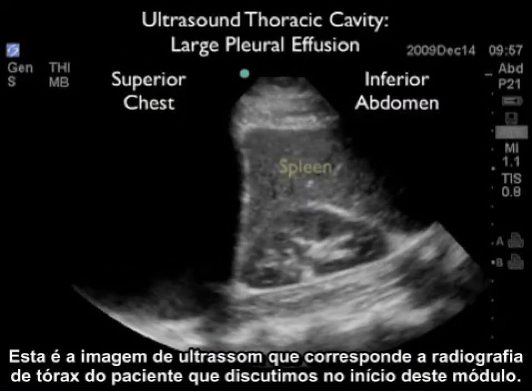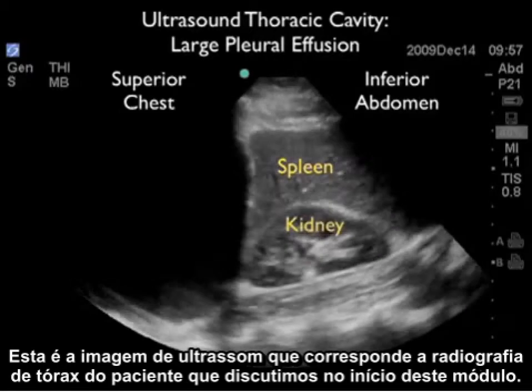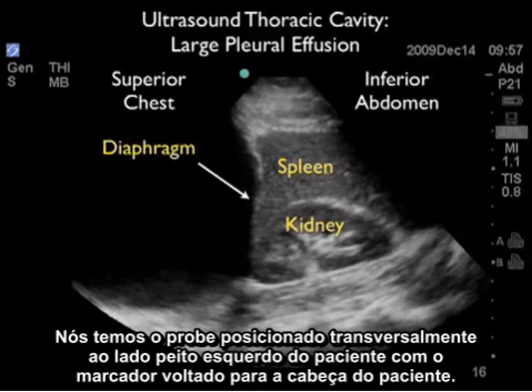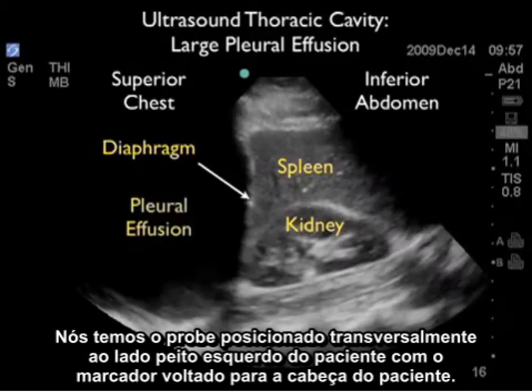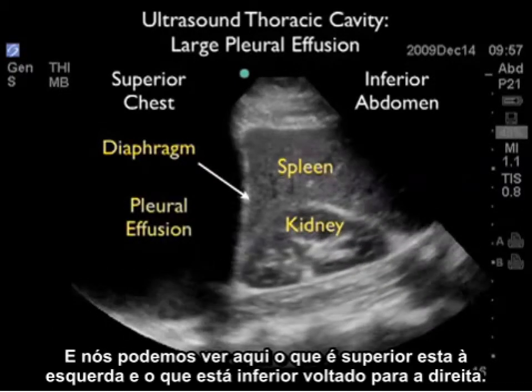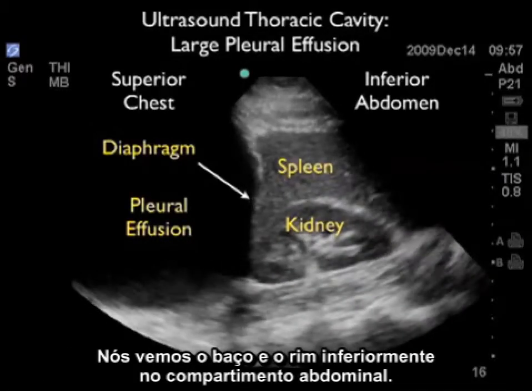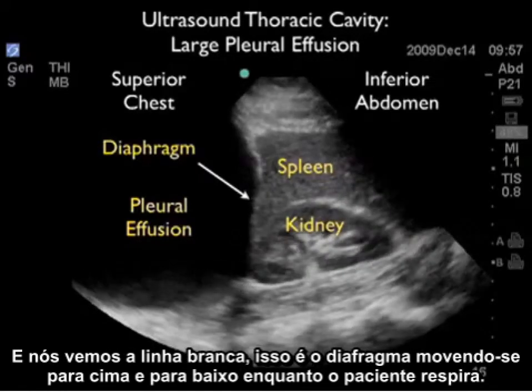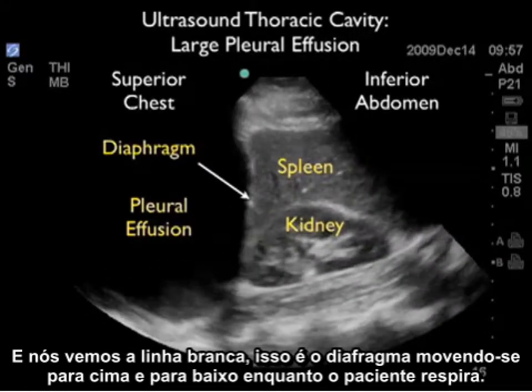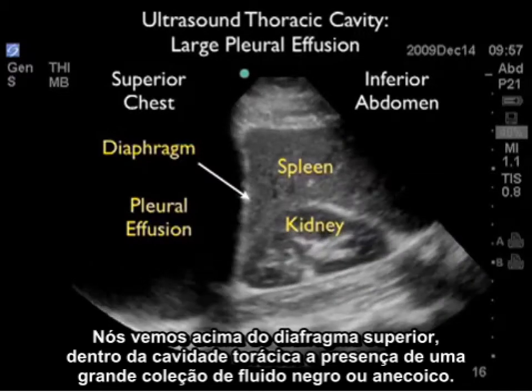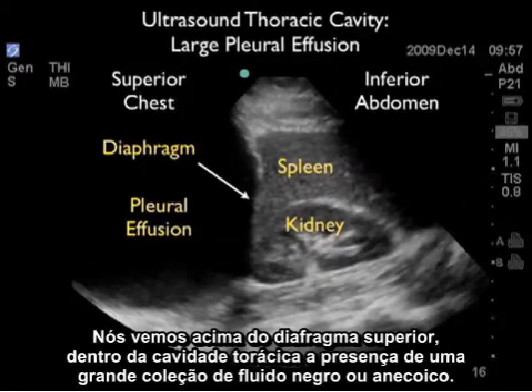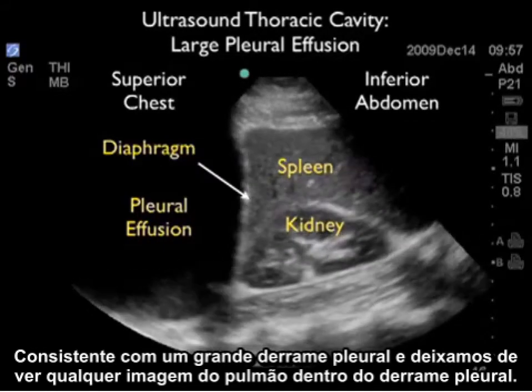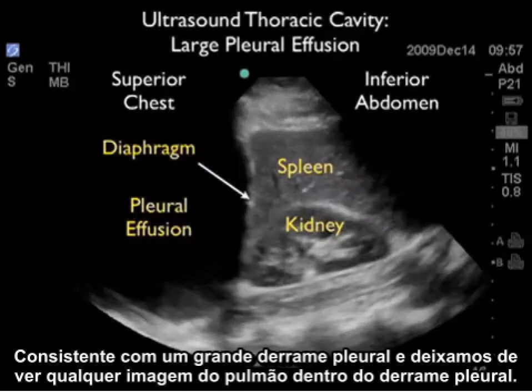This is the ultrasound image corresponding to the chest x-ray from the patient discussed at the beginning of the module. The probe is positioned across the patient's left side of the chest with the probe marker towards the patient's head. We can see superior towards the left and inferior towards the right. We note the spleen and kidney inferior in the abdominal compartment, and we see the white line that is the diaphragm moving up and down as the patient breathes. Above the diaphragm, in the chest cavity, we note the presence of a large dark or anechoic collection of fluid consistent with a very large pleural effusion, with no lung appreciable within this effusion.